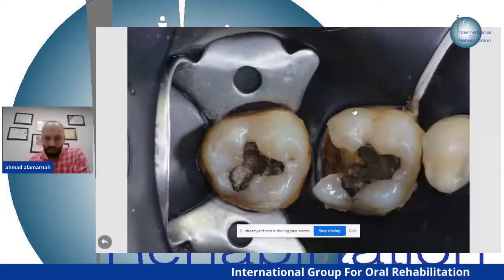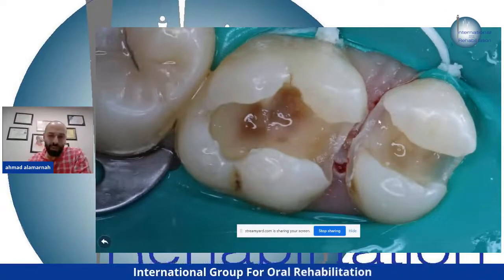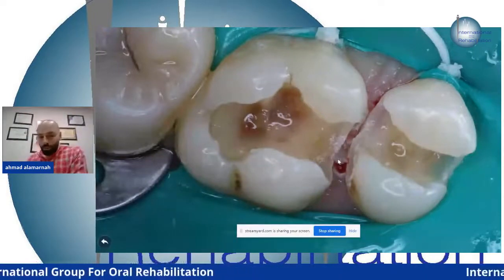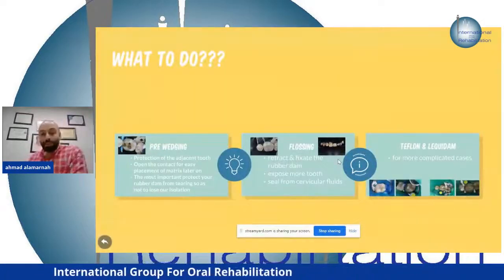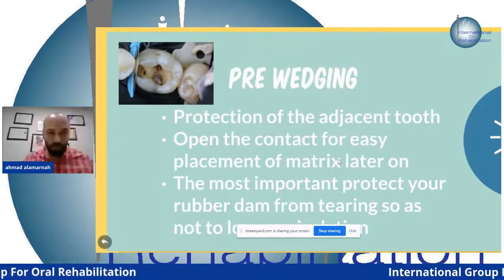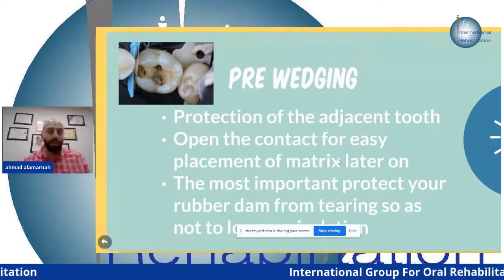When I first started using rubber dam, I encountered common problems: tearing of the rubber dam and injury of the interdental papilla. Those problems have solutions. If you have a class two cavity, pre-wedge before initiating your preparation. Some lecturers say to do preparation first then apply rubber dam — but no, because you don't know if you have a pulp exposure, and you will then have bacterial infection and later restoration failure.